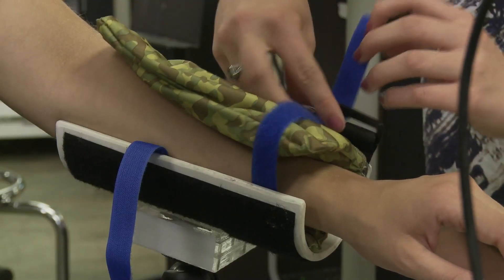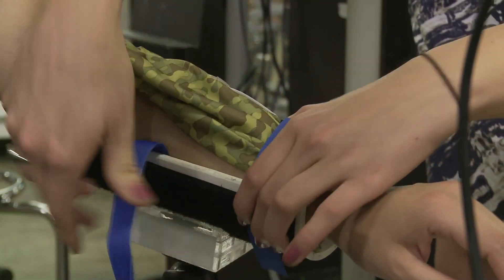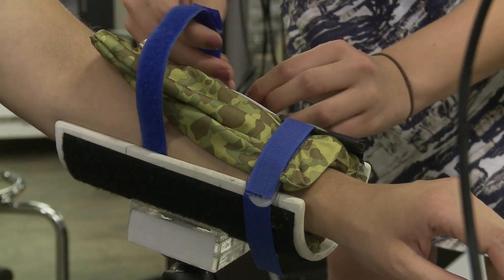This is the RICE Helping Hands device, the Dynamite — a wrist rehab device for cerebral palsy patients.